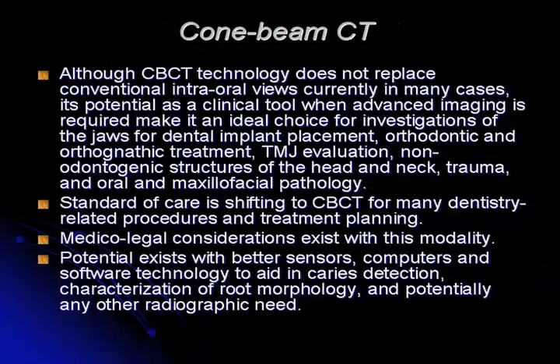And finally, I just want to say that the potential exists with better sensors, computers, and software technology to aid in caries detection, characterization of root morphology, periodontal evaluation, and any other radiographic need in dentistry. So, with that said, this is probably why we're going to see this becoming more and more the standard of care for any imaging study that's going to be done in dentistry prior to treatment planning or for follow-up for treatment.